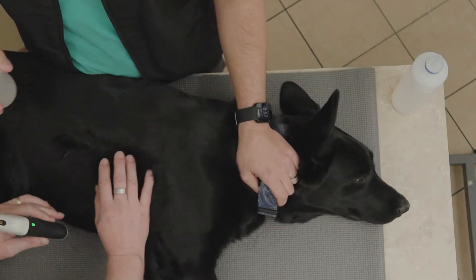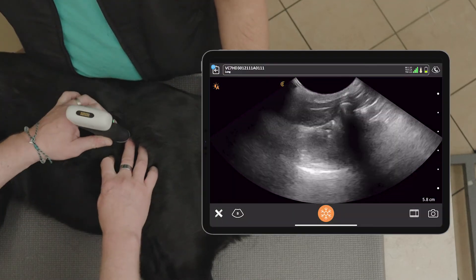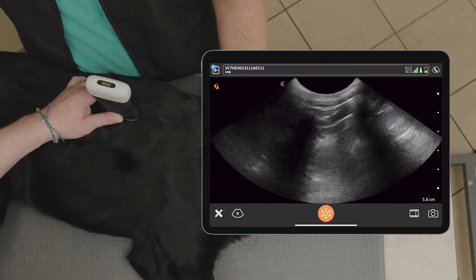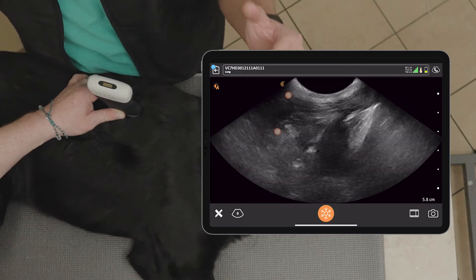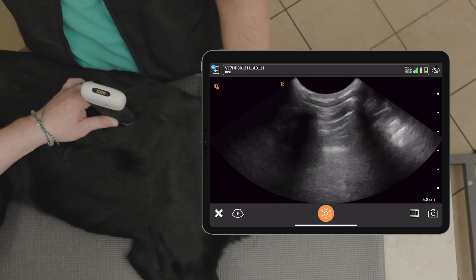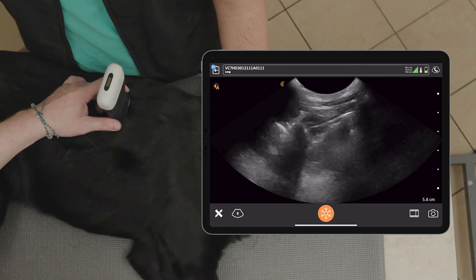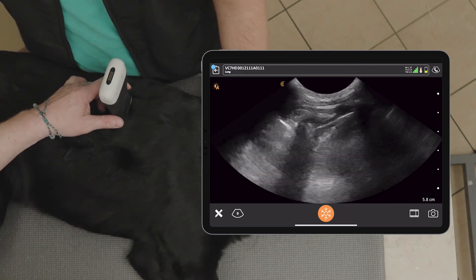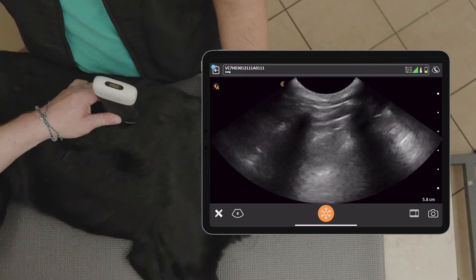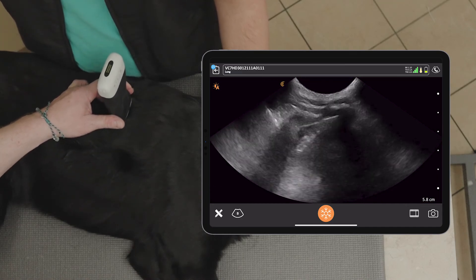Now let's show what the dorsal border looks like. We'll go straight up off lung, from cranial to caudal, and follow up until we find that dorsal border. What that looks like is you see the pleural line, you see the pleural line — then boom, you lose it, because now you're in muscle, the epaxial muscles to be exact. You can come right back down and you're at the highest point. We can also turn the probe parallel to the ribs and see where that lung sliding disappears at those sublumbar epaxial muscles.